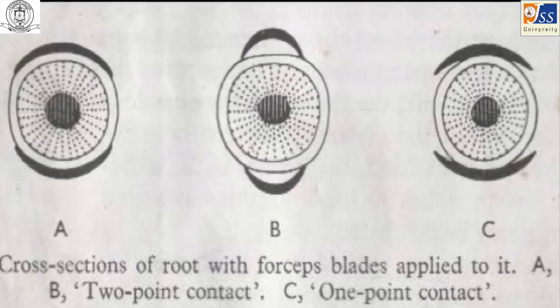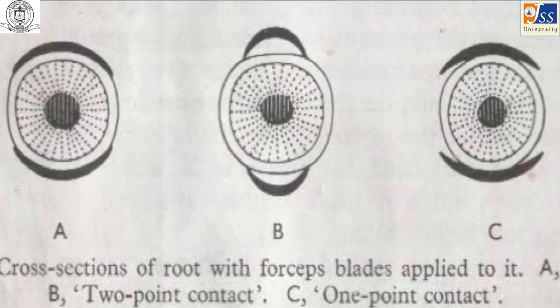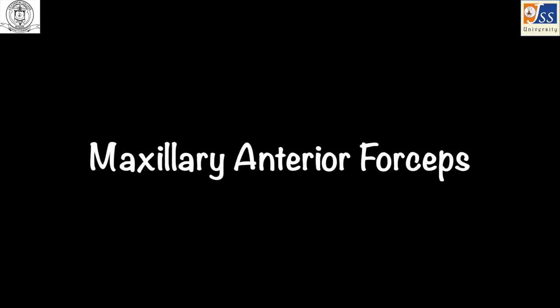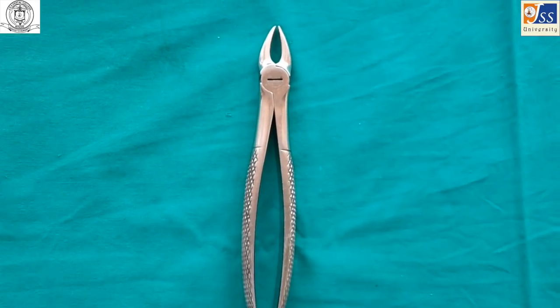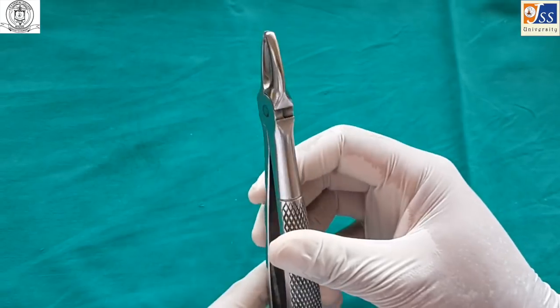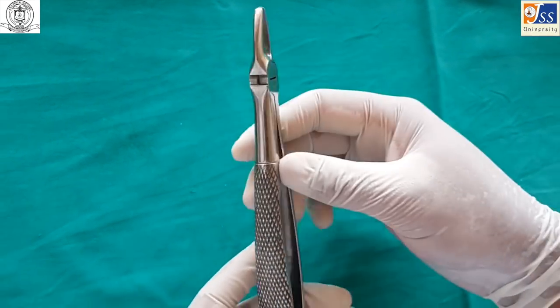One should be careful not to crush a finger when using forceps. The maxillary anterior forceps is used for extraction of maxillary anterior teeth. This forceps is completely straight.